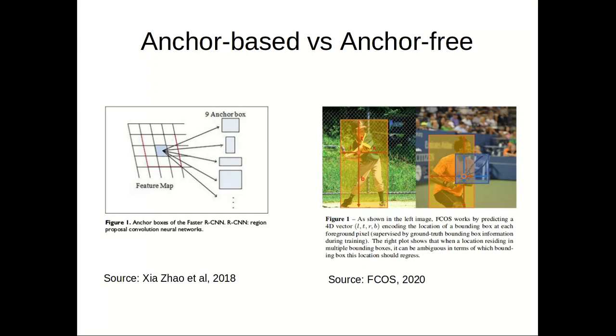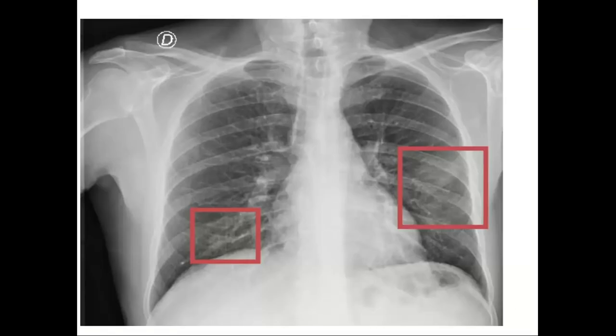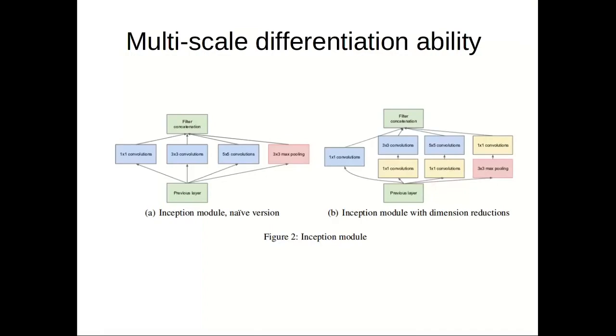Another reason for going in the anchor-free direction involves the nature of the specific medical imagery task, which is very different from detecting, for example, very structured real-world objects. As you can see in the ground truth bounding boxes in the image, here we try to detect amorphous opacities. As there isn't really any high-level structure inside the opacities, much of the advantage of the convolutional model is lost here, and with or without anchors, our model will anyway not have the ability to correlate a small receptive field to larger characteristic shapes. Anyhow, supplying our model with real multi-scale and multi-shape observation abilities is essential here.